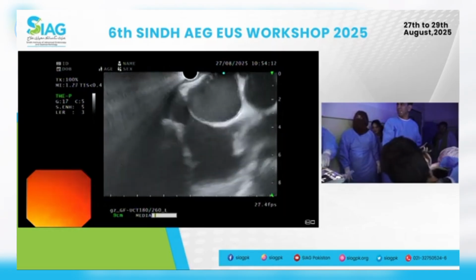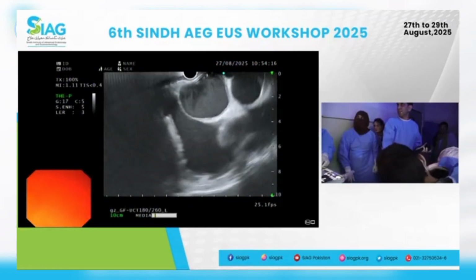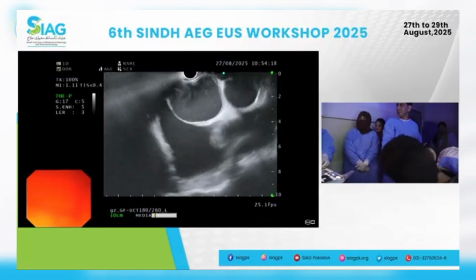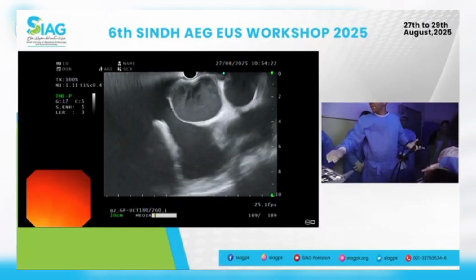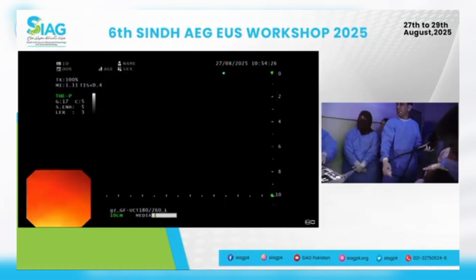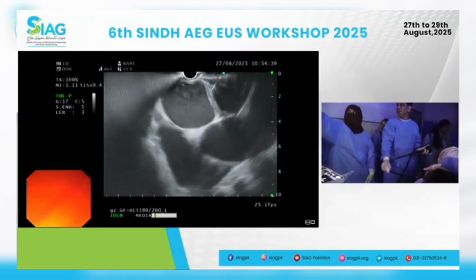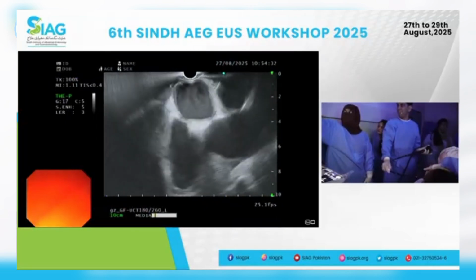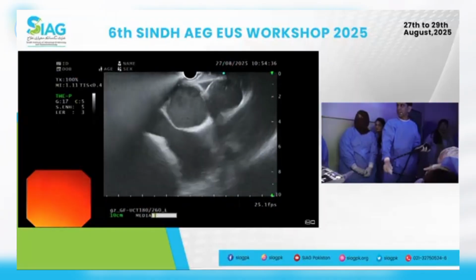सो लेफ्ट एट्रियम, लेफ्ट वेंट्रिकल, एओर्टा एंड पल्मोनरी आर्टरी. ओके, सो फ्रीज कीजिएगा इसको, जस्ट फ्रीज इट. ओके, सो लेफ्ट एट्रियम, लेफ्ट वेंट्रिकल, पल्मोनरी आर्टरी ऑन द टॉप एंड एओर्टा ऑन द राइट. अनफ्रीज प्लीज. Left atrium, left ventricle. Yep. Aorta, good. Excellent.